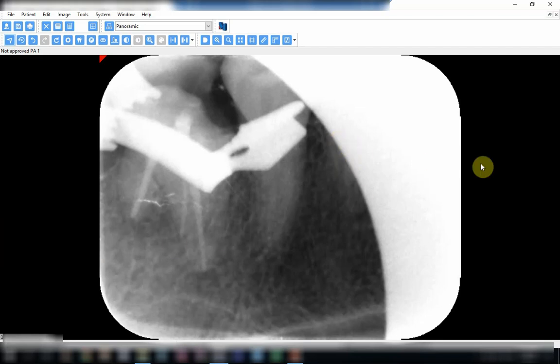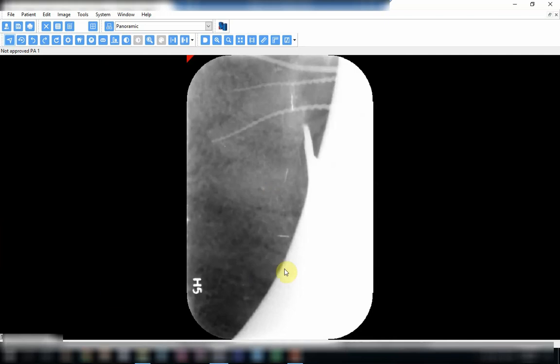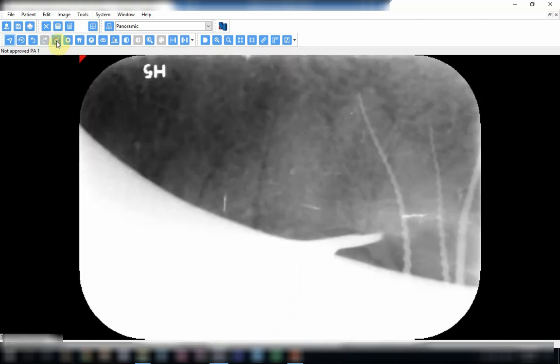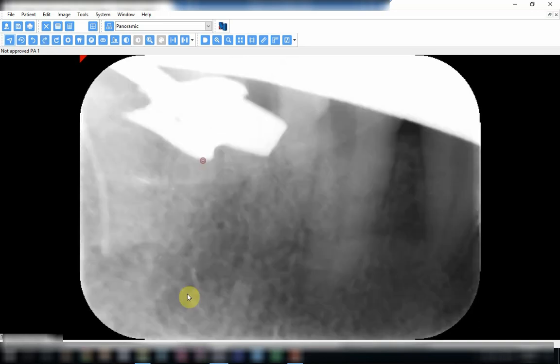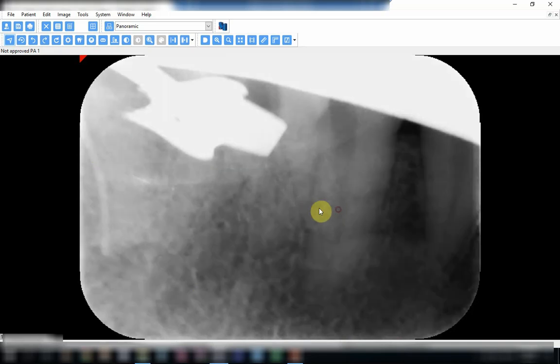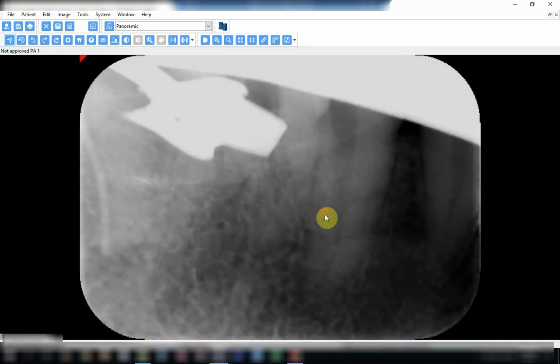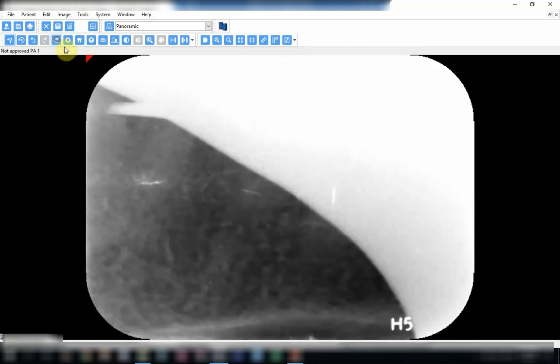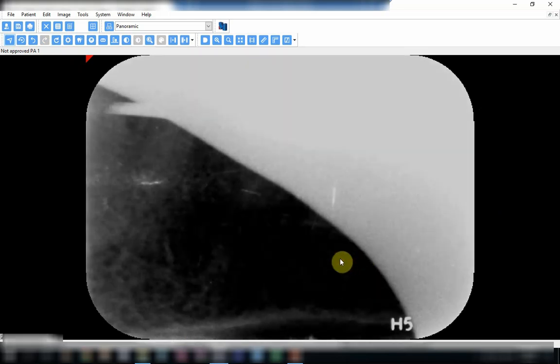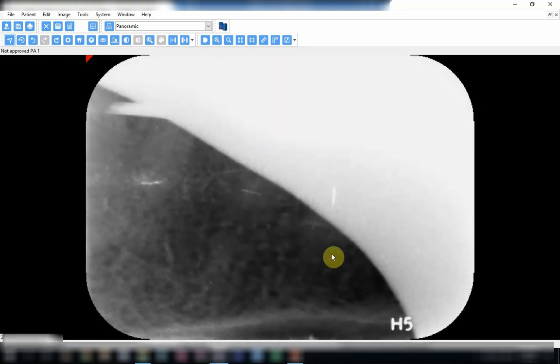Another cone cut. Cone cut from the top. Another cone cut which has completely... you can't even know which area was taken.